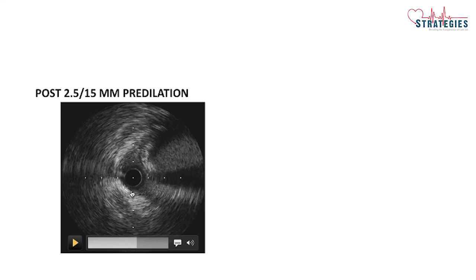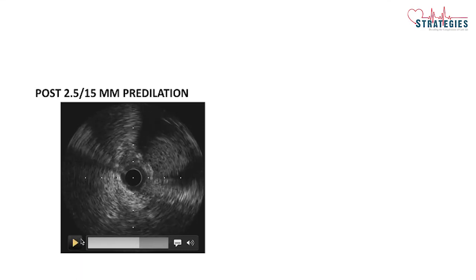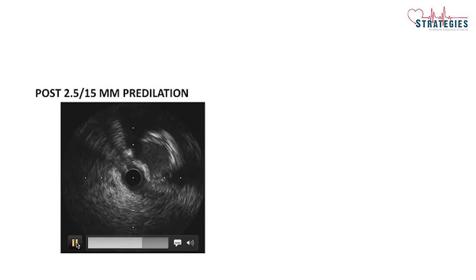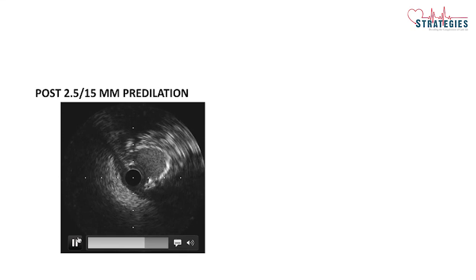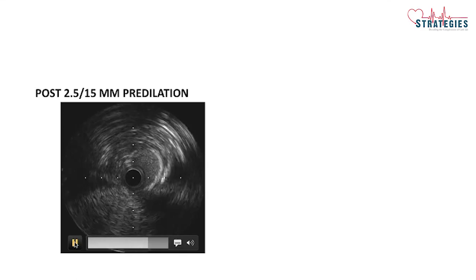You can see septal artery is coming and it joins LAD, but there is a clear subintimal wire entered back into true lumen, and this is a reverse CART over a balloon kept into septal. Part of the dissection flap actually came in between the LAD lumen over the septal artery. So now the septal is joining, and this is LAD.